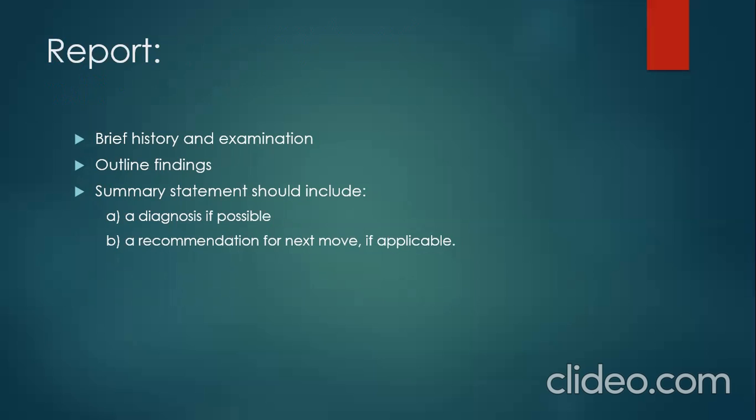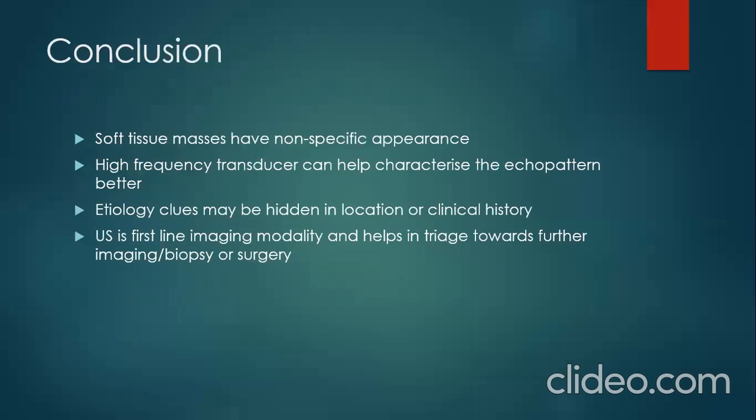you might need to give a recommendation. What is the next move for this patient, if applicable? Does this patient need to go for further evaluation with an imaging modality? Do you think we need to do biopsy? Or do you think you need a second opinion from someone? So just put a recommendation after you're done.